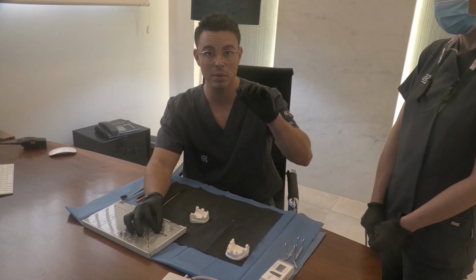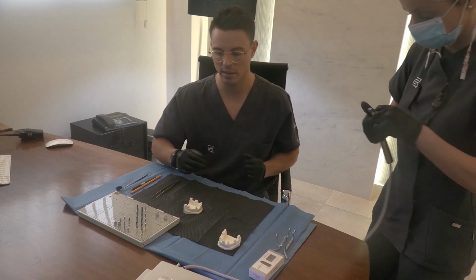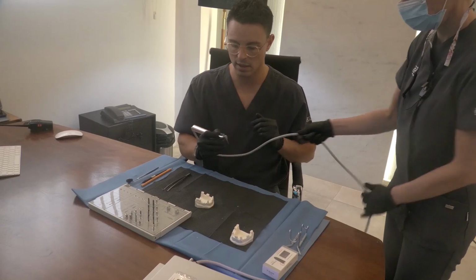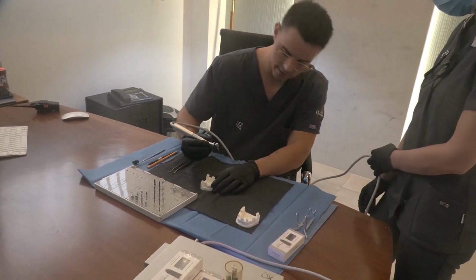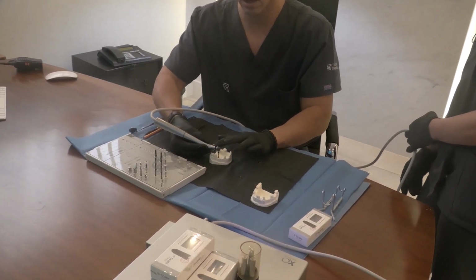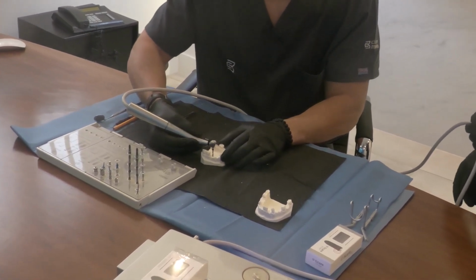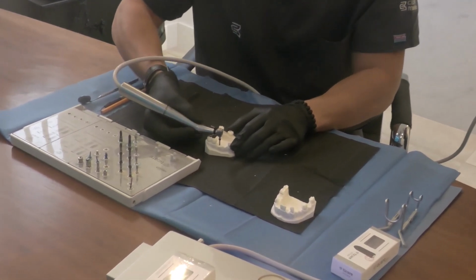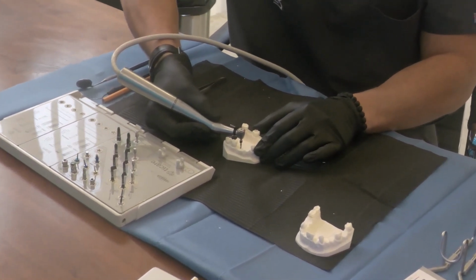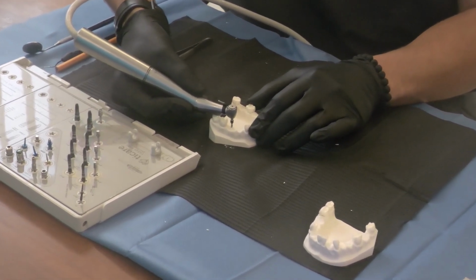So I will have that extra millimeter in order to submerge the dental implant, and that's what I'm going to be doing accordingly. Take your time to treatment plan, because that's what will dictate success in the short and also in the long term. Again, it should follow a parallel direction, and after you have selected the ideal drilling revolutions per minute, it should be applied in an in and out motion in order to get rid of all the debris.